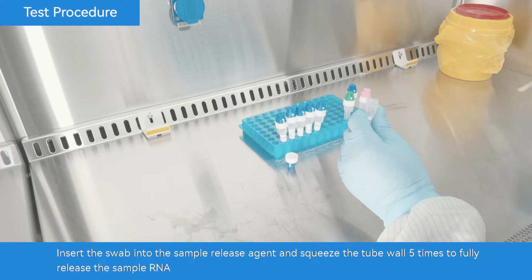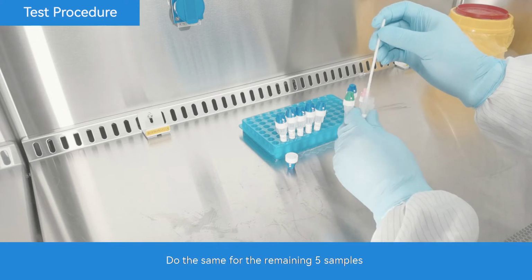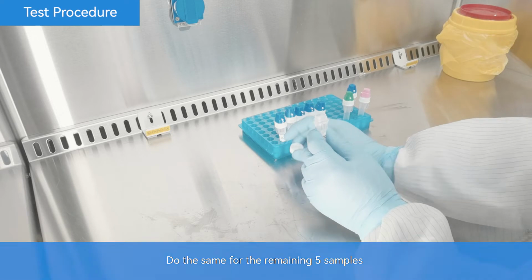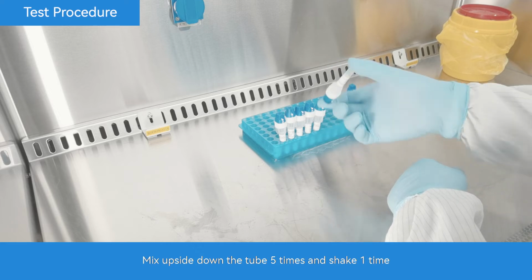Insert the swab into the sample release agent and squeeze the tube wall 5 times to fully release the sample RNA. Do the same for the remaining 5 samples. Mix upside down the tube 5 times and shake 1 time.